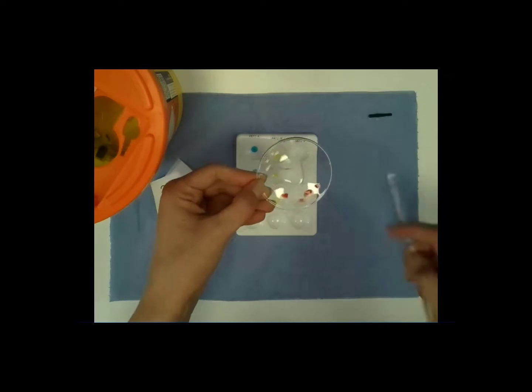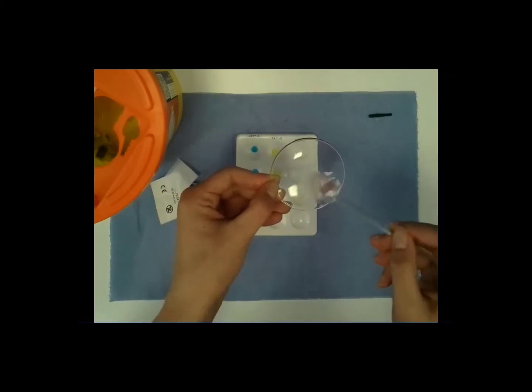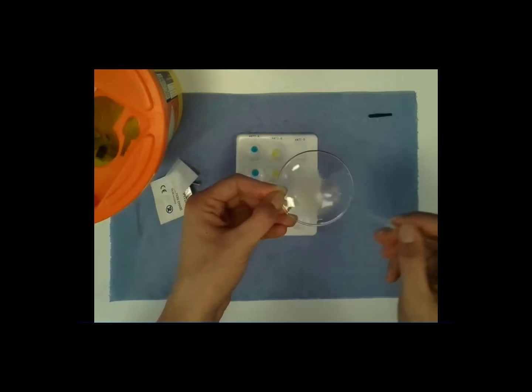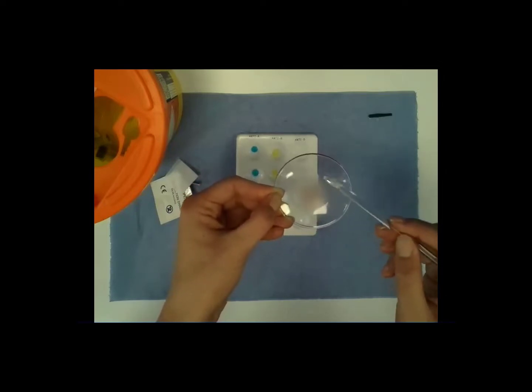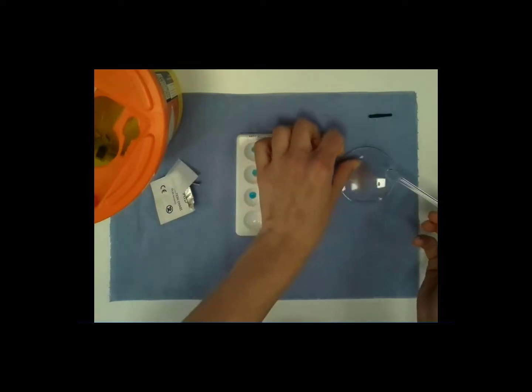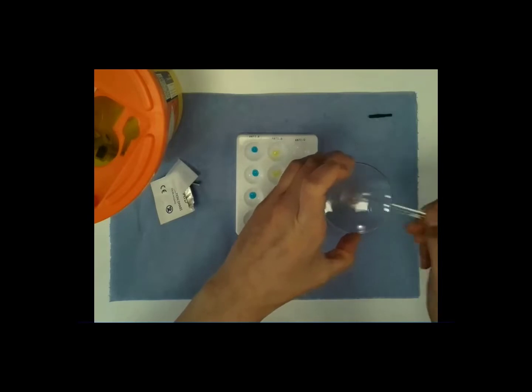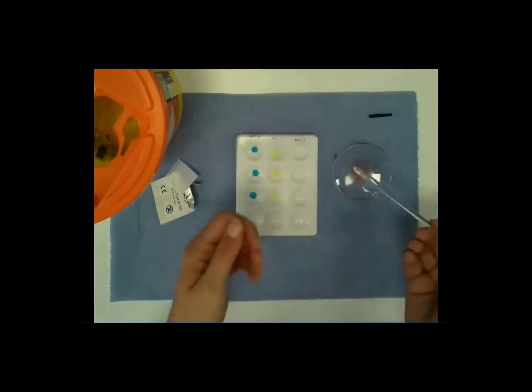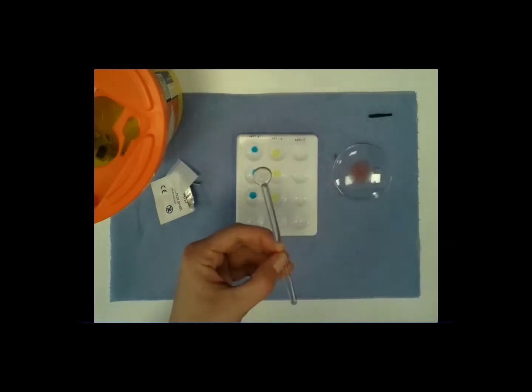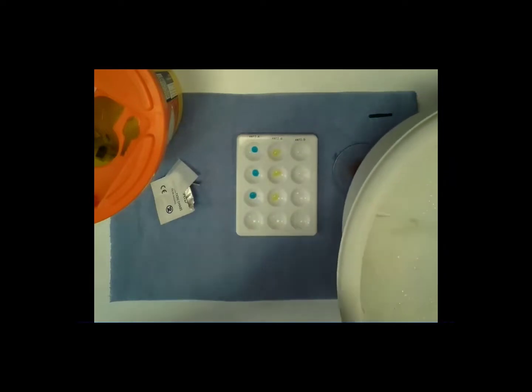Once you've spotted the blood on, use the glass stirrer to mix it in with the saline. You're looking for a pinky colour to the water. Once you've finished, and you're satisfied that you have enough blood in your sample, you can get rid of the watch glass stirrer. This needs to go into the washing up bowl, because we don't dispose of them and instead clean them.